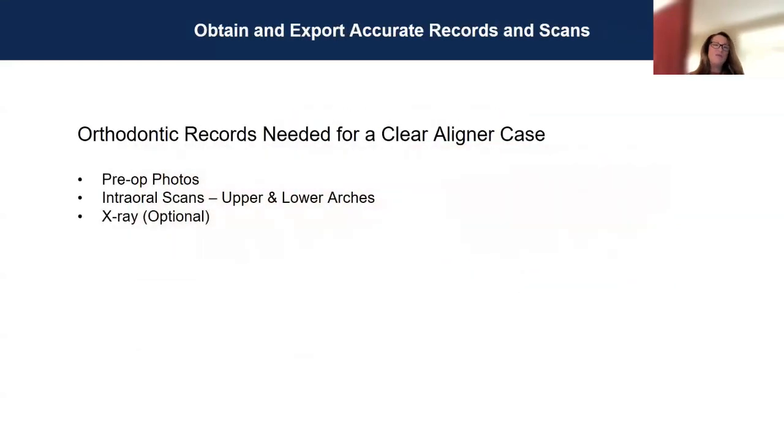So then, before I get into the records needed for clear aligners, any questions on the malocclusion or which cases to start off with? But I'll also tell you that in your practice, you'll see which ones are really great to start off with, and that is ortho relapse. Because back in the day, we were told after their braces came off to wear their retainers only at night for a little bit, and then after 6 months, 8 months, they didn't need to wear them anymore, or they chose not to.